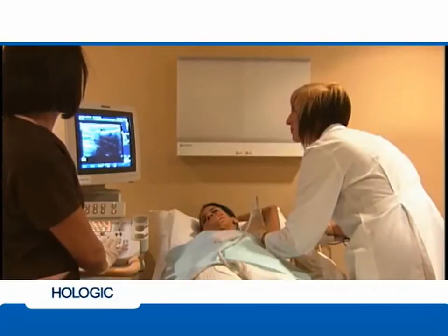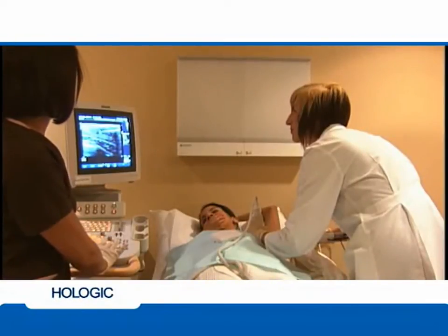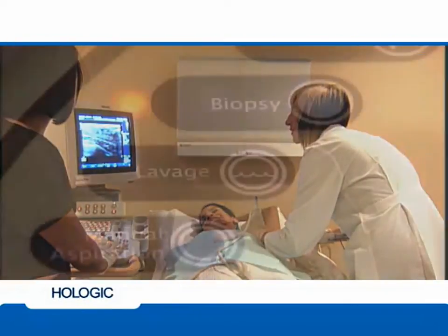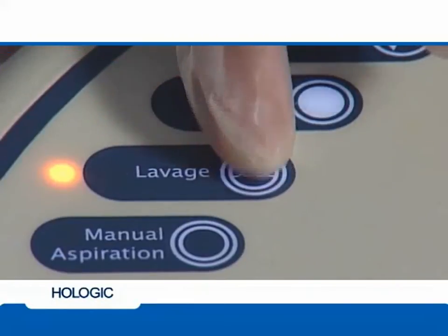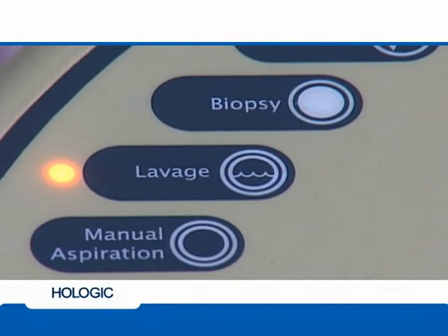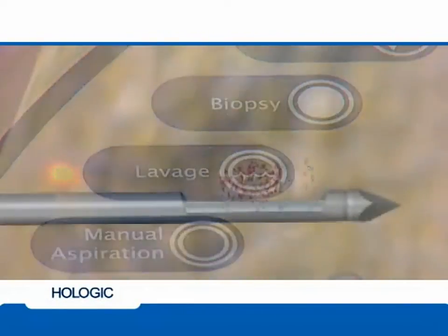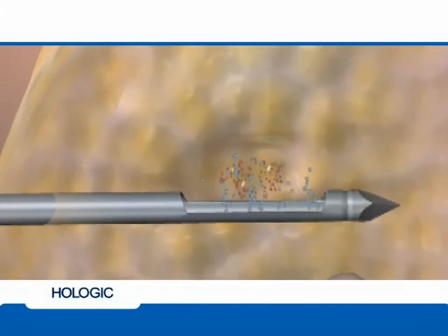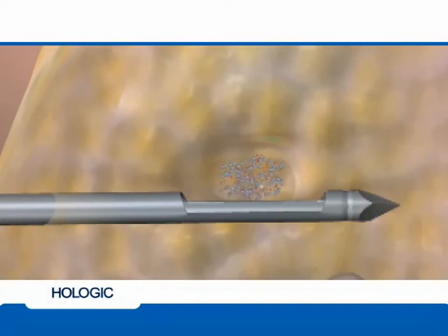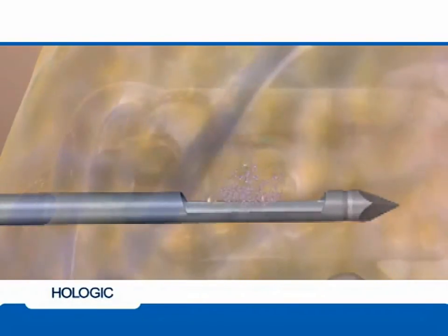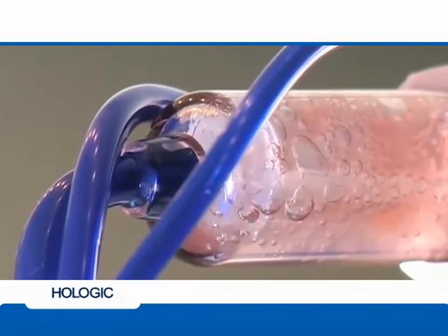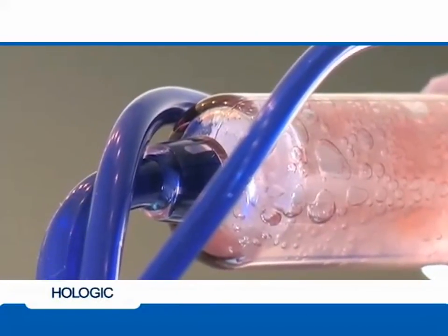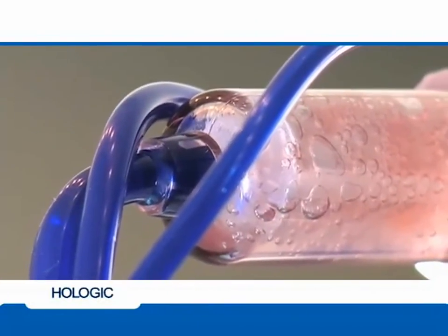When tissue acquisition is complete and with the needle still positioned in the breast, you may choose to switch the console to lavage mode by pushing the button marked lavage. Lavage mode continuously delivers saline to the biopsy site and aspirates the biopsy cavity, allowing loose tissue and other fluids to be cleansed from the site, clearing it for marker placement. Lavage the cavity until the fluid in the collection chamber indicates the cavity is clear.